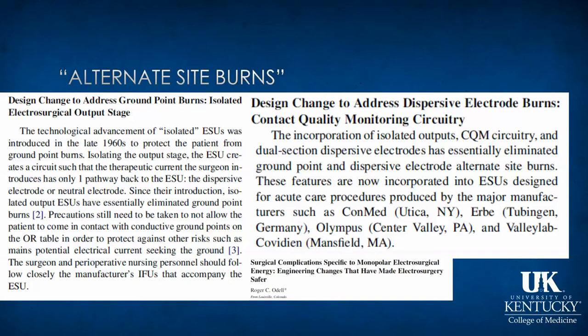And also, I've learned that while there may be systems or equipment that is used to monitor this leakage, it's not universal, and most companies put the burden of safety on the perioperative nursing personnel and the surgeon, stating that they should follow the manufacturer's instructions for use very closely.